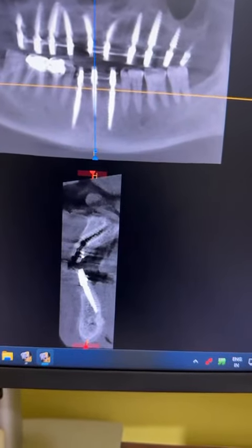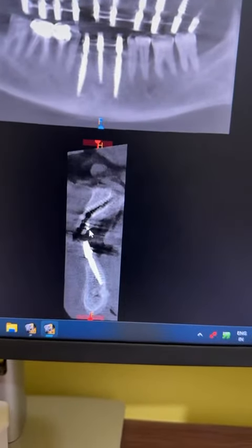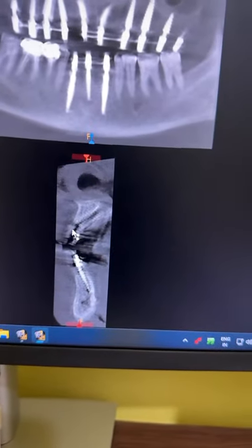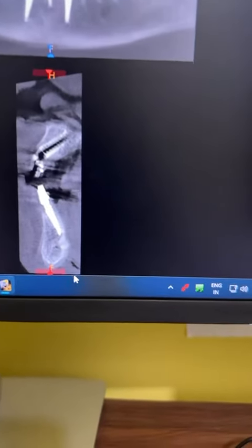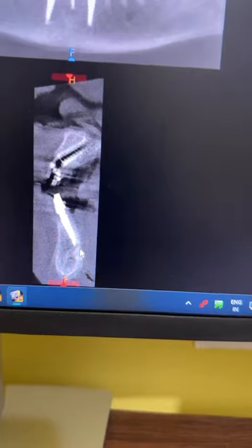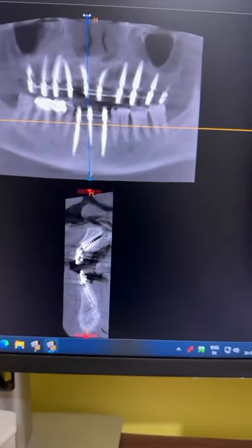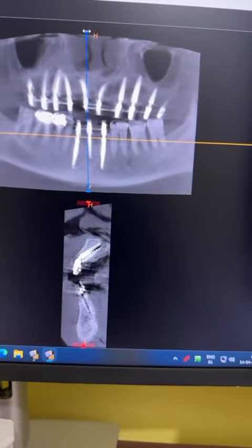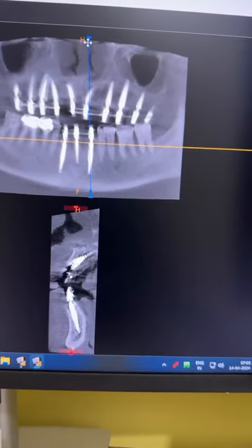The middle implant is a very small diameter, 3.5 x 14. If you see clearly, you can see the lingual vessel coming here — this is the lingual vessel. So whenever we are placing an implant in the anterior mandible, it is better to select a shorter length to avoid going into those lingual canals.